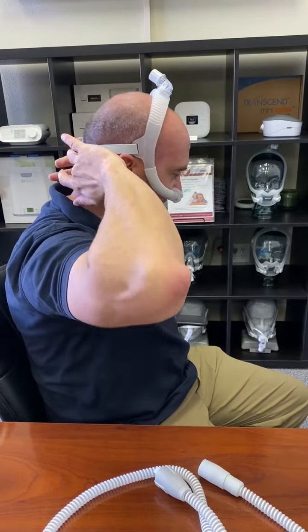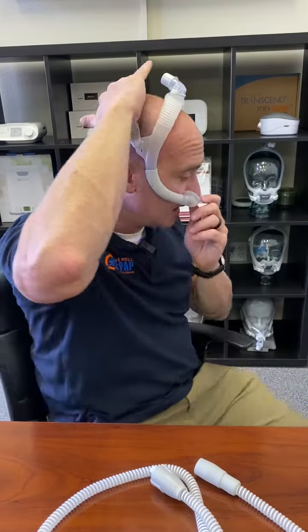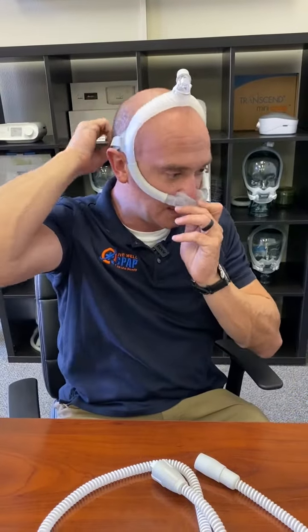The next piece I'm going to go over is the N30i and the P30i. As far as the fitting goes, the N30i sizes by width of the nose and then length of the nose. Your home care provider should have a template in every one of these masks that they can measure you on. A lot of times you can eyeball it, but I recommend eyeballing it and then double checking with the manufacturer's templates to get a good fit.